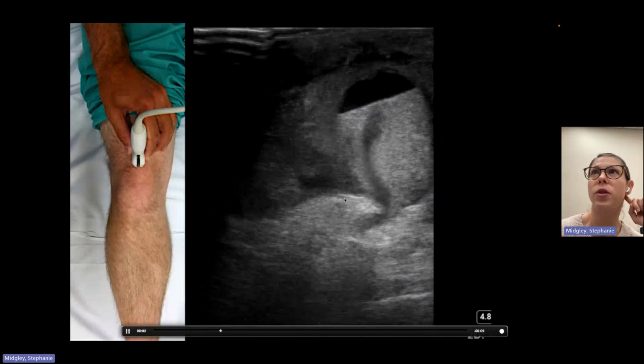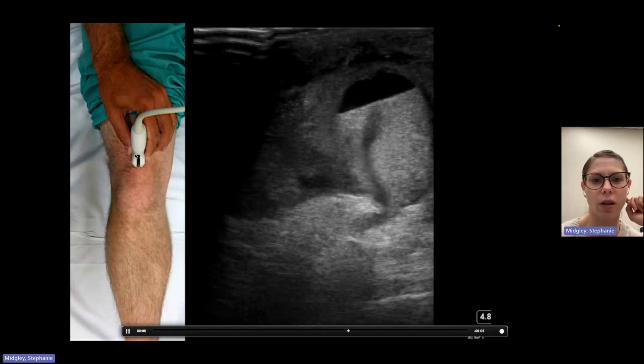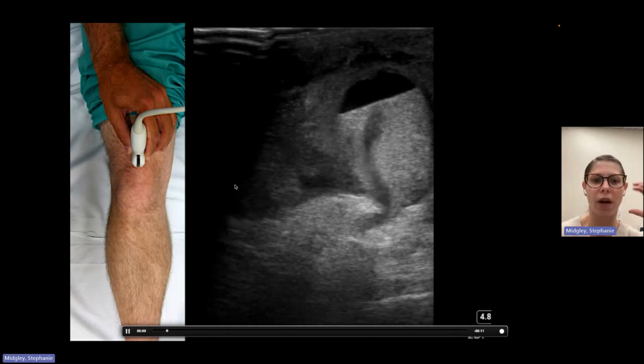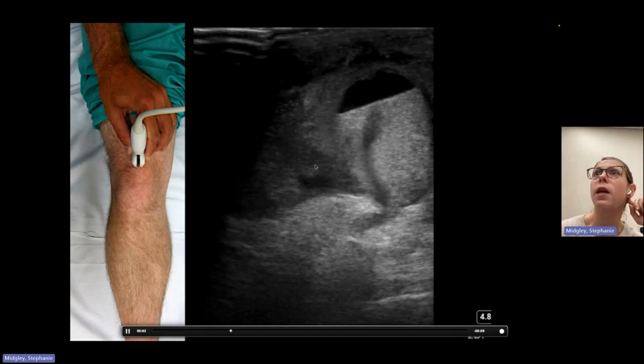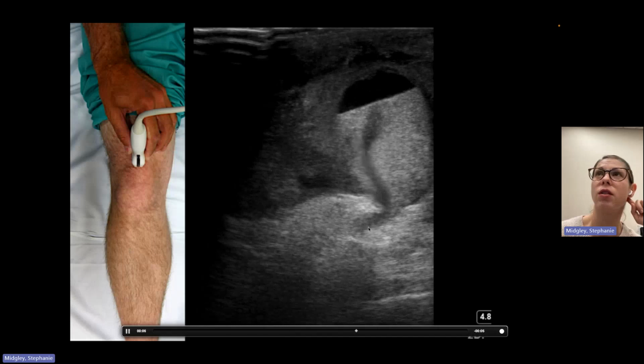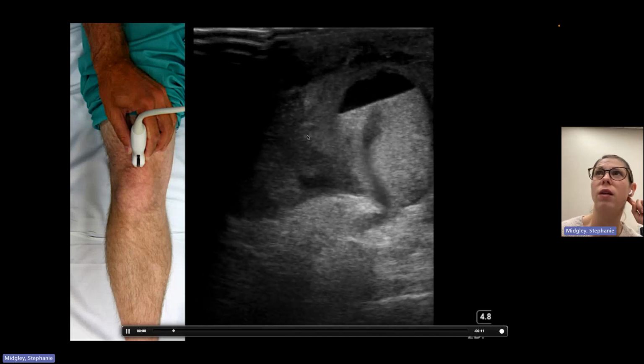This was another hematoma. So this was a knee. Actually, this was a little old Nana that had fallen right on a bent knee, and her knee was sort of blowing up in front of our eyes while we were scanning her. It was crazy. We throw a probe on, and you can see the active extravasation from a broken blood vessel coming right into this hemarthrosis that she is developing.